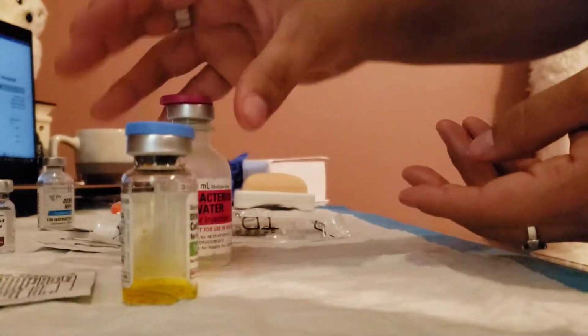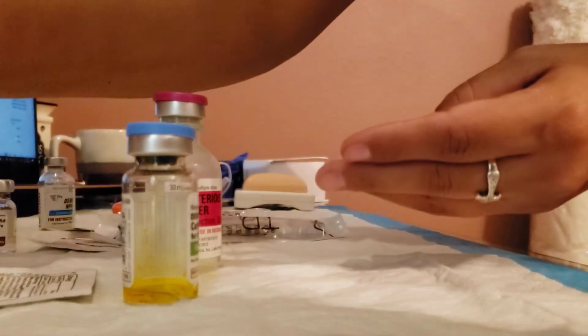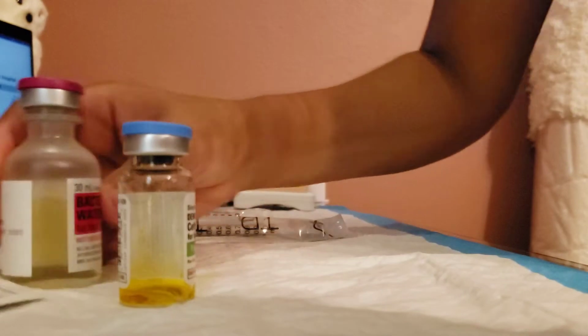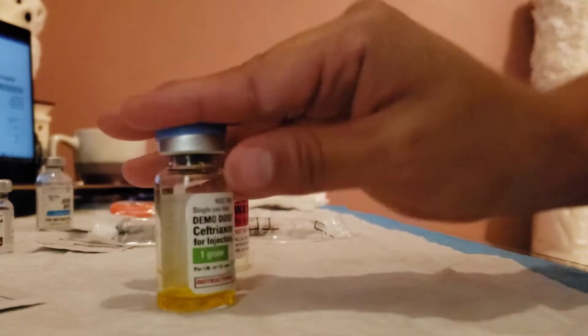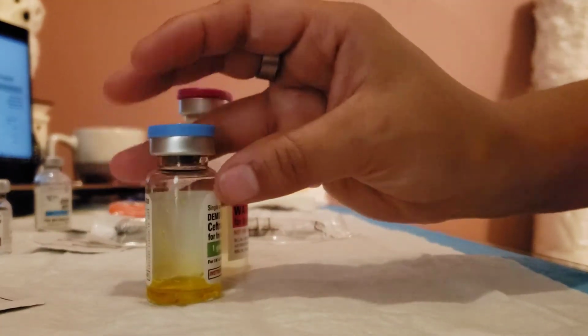I'm going to begin and prepare. So this is my 1 gram that I'm not going to have to do any dosage on because there's already 1 gram in here.